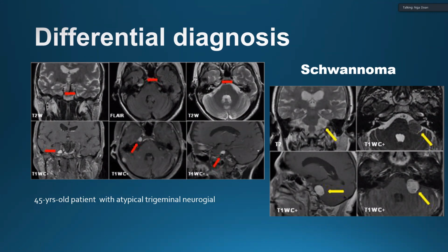Yes. Yeah. And do you have a clinical case which shows the neurovascular conflict on the fusion image? Yeah. Two cases.